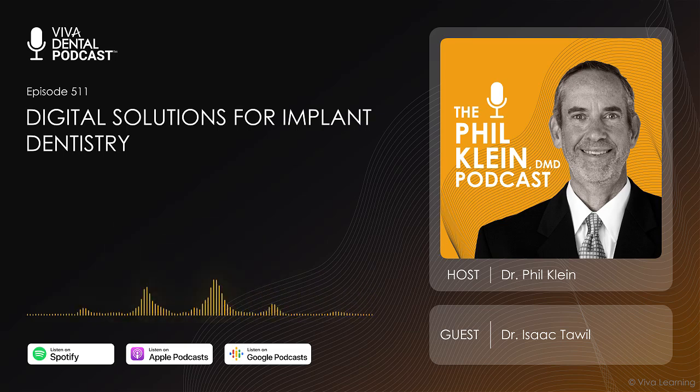So we can do same day or next day printing, which looks a lot nicer. We have much nicer anatomy because we don't have to grind down so much on the occlusion. We have very nice prosthetics. And it's all happened more recently because the materials in the 3D printer, the resin, has gotten dramatically better. And also the curing process has gotten dramatically better.